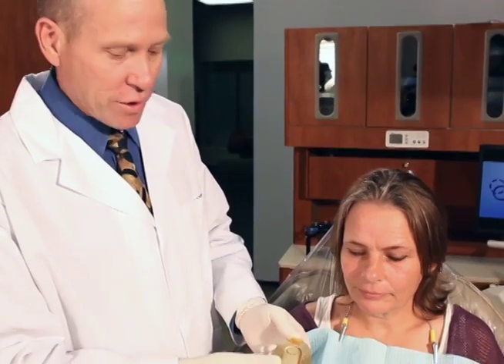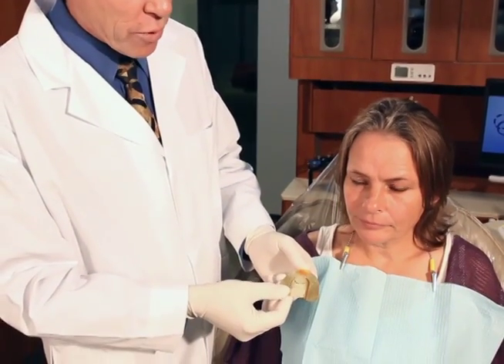Hello, my name is Tom Lee and welcome to my demonstration of the Panitent Bite Tray. The Bite Tray is used for doing interocclusal records such as centric relation, protrusive, or even lateral border records.